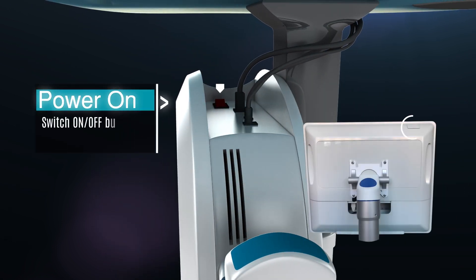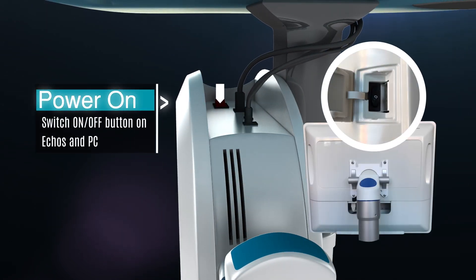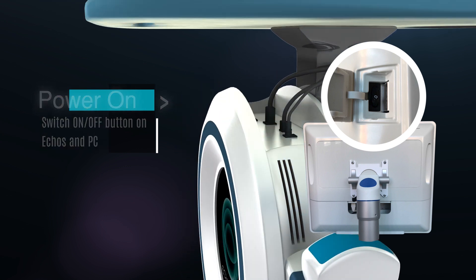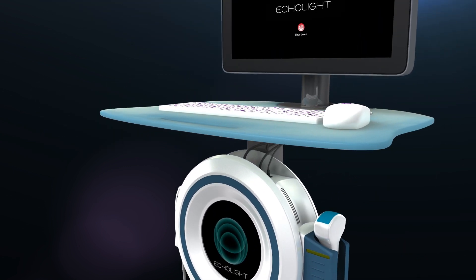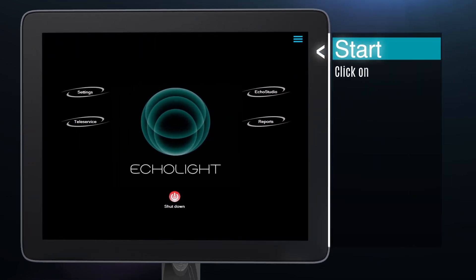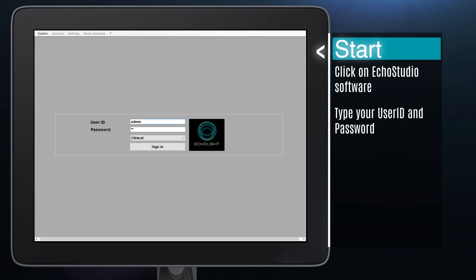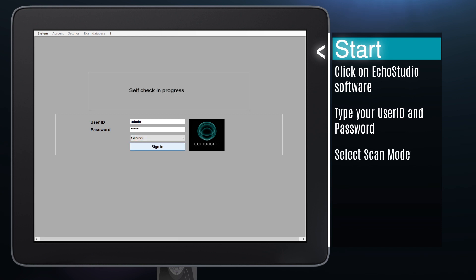Turn on the computer and when the operating system is ready, turn on the ECOS device. Click on the top right icon to start the ECOS Studio software. Type your user ID and password to log in, select clinical or training scan mode and click on sign in.